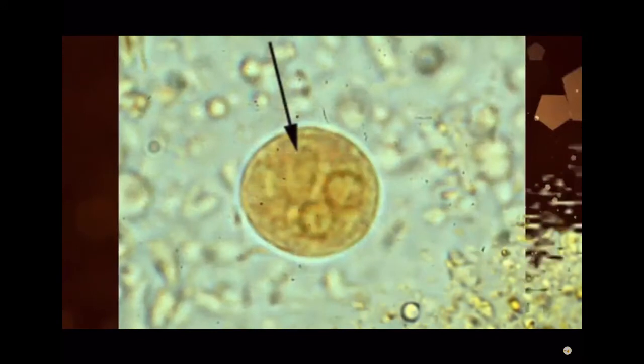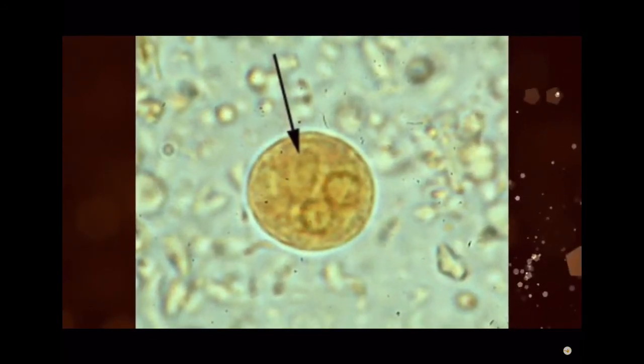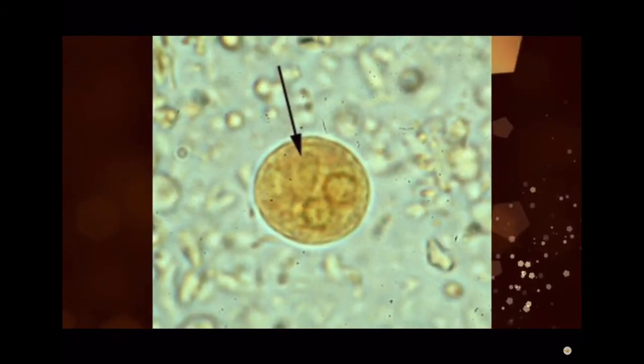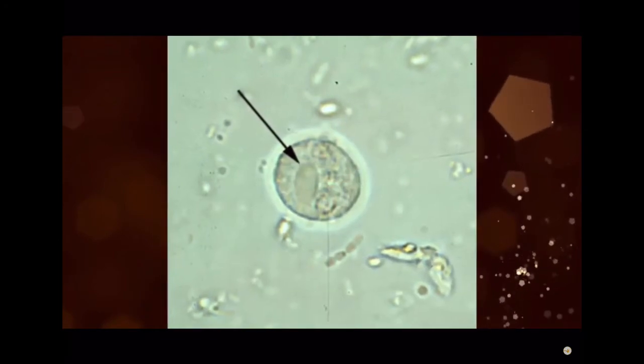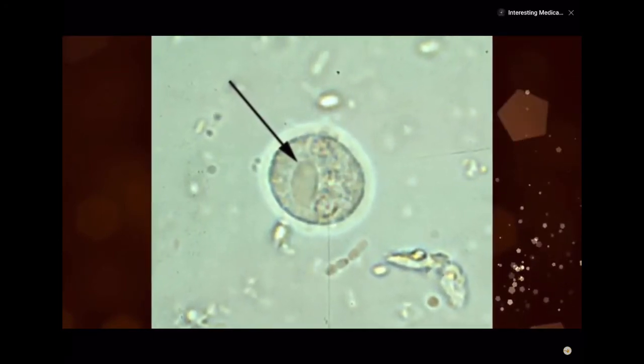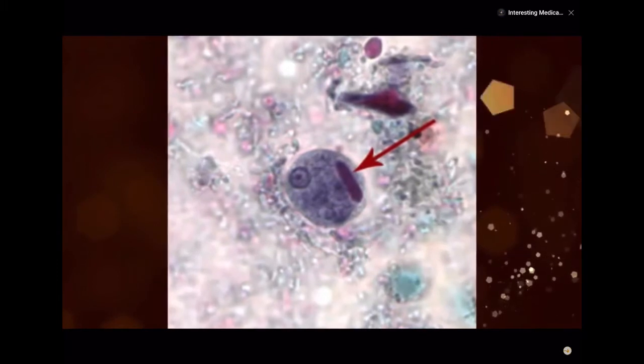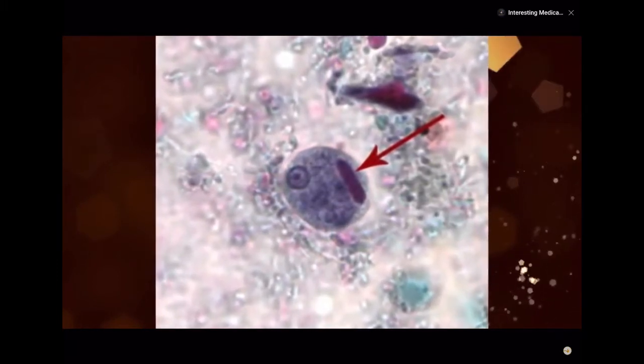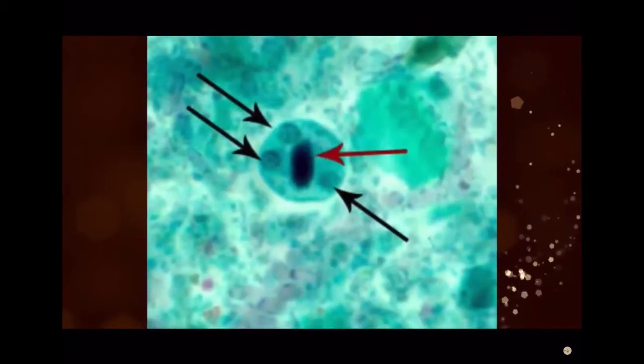Cytoplasm is yellowish-gray in color after staining with iodine solution, granular and dirty in appearance. Cysts usually measure 12 to 15 micrometers. The membrane is thin, regular and circular.